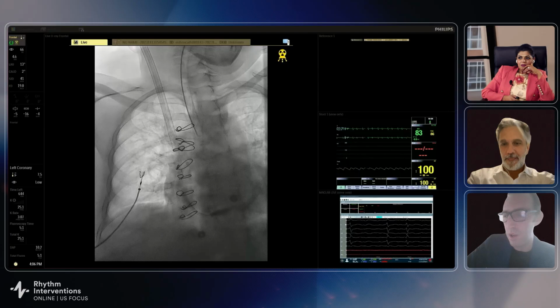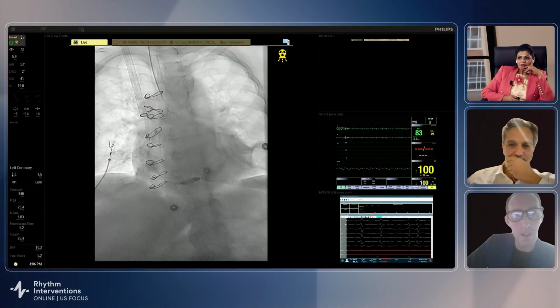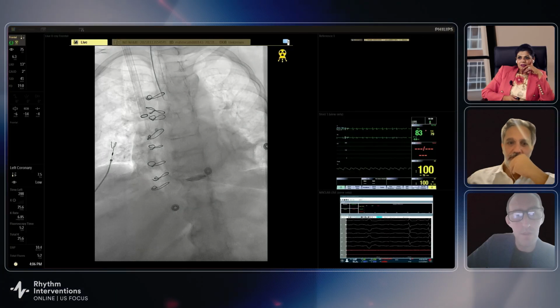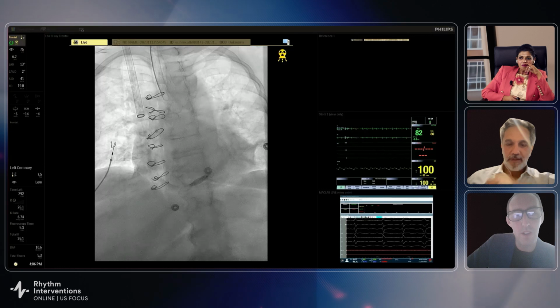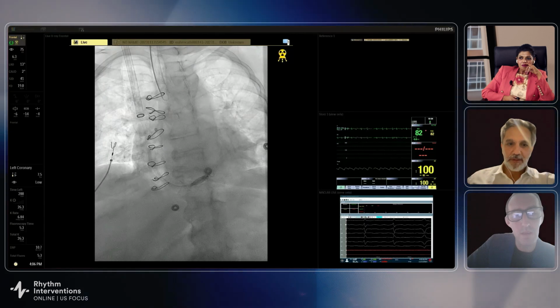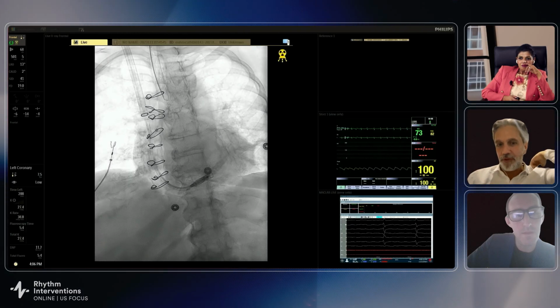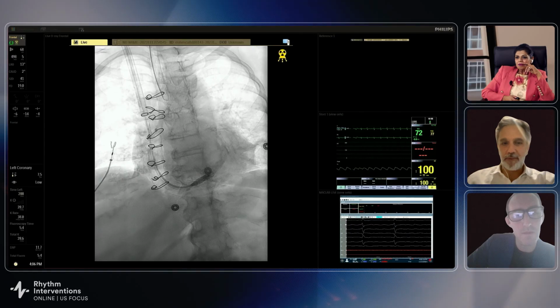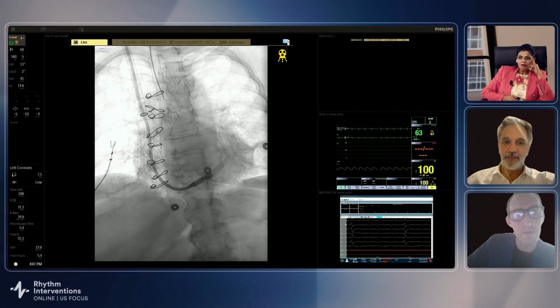After the recent effort in the ablation world about utilization with large bore sheaths and the use of sedation, do you find that you then try to use general anesthesia for these cases? Not really. For these leadless devices, usually they're pretty fast. The only reason we used anesthesia, early in our experience, was comfort.